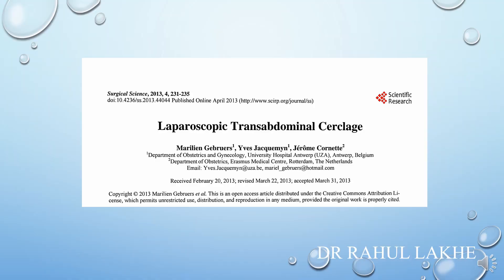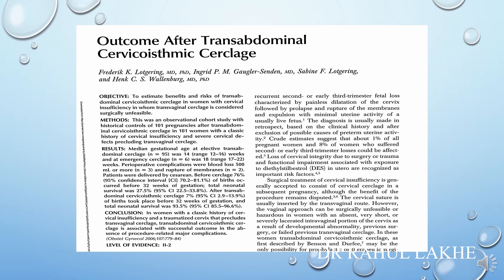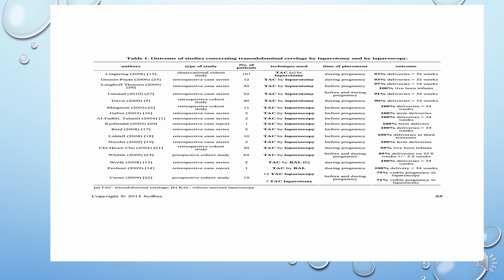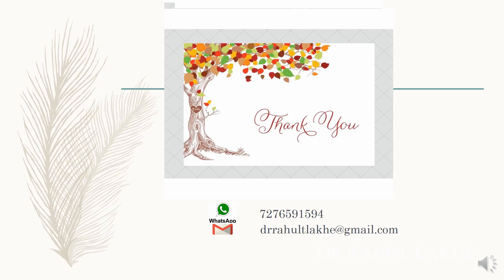Here you can easily appreciate the mersilene tape just above the uterocervical junction. After reviewing various literature and papers published, transabdominal cerclage has a very successful outcome in patients with a classical history of cervical insufficiency — absent cervix, short cervix, traumatized cervix, or scarred cervix — which precludes the chances for transvaginal cerclage. Some studies clearly mention that laparotomy and laparoscopy for transabdominal cerclage have no significant difference in obstetric outcome, while several studies mention laparoscopy has a clear edge over laparotomy in terms of shorter hospitalization, less postoperative pain, and faster recovery. Transabdominal cerclage performed by laparoscopy seems to be a feasible technique in cases where transvaginal cerclage has failed or is technically impossible. I hope you liked my video — if you have any queries, you can email me or WhatsApp. Thanks a lot.